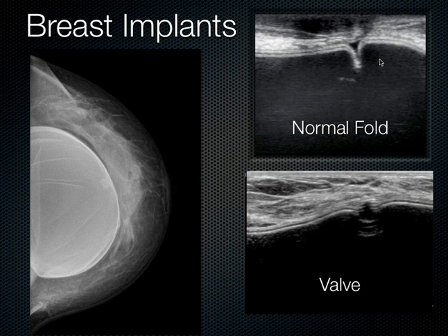And this is a normal amount of free fluid seen within the capsule. See, there are these two layers. This is the capsular free fluid seen there. That's normal to see. And I like this mammogram here because it shows how you can get these folds in the implant.